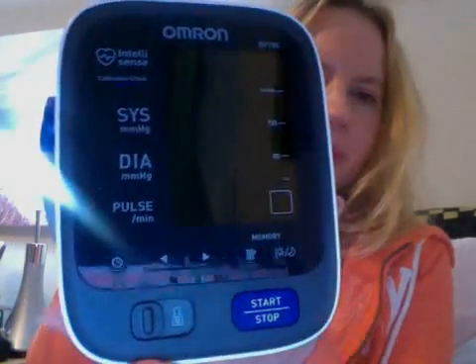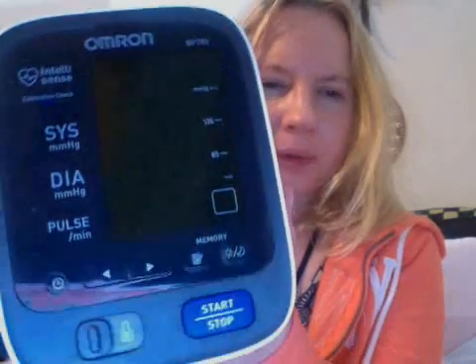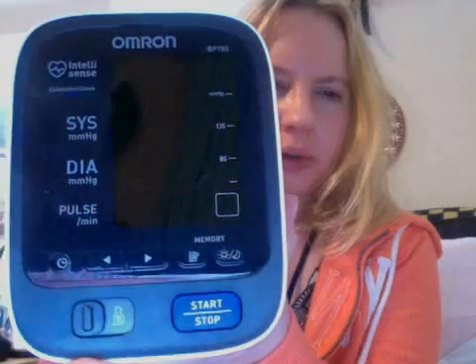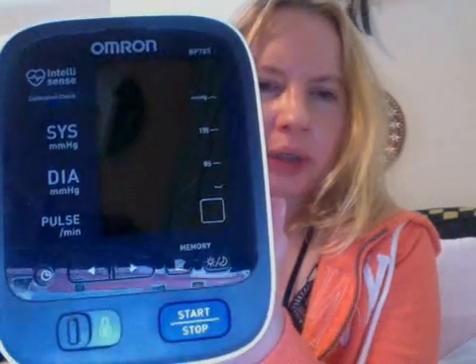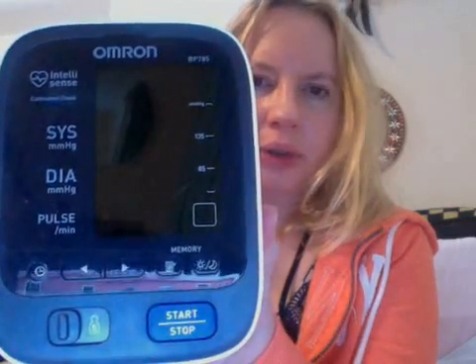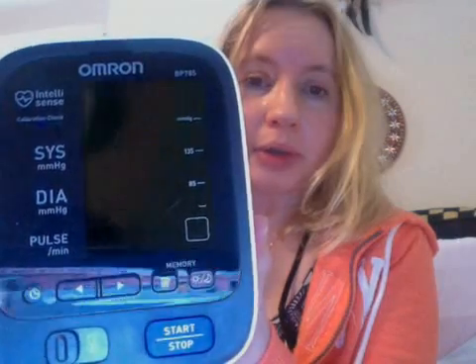First, you need to get a good blood pressure machine. I just bought this recently. It's a super duper machine which does all sorts of things. It tells you systolic, diastolic, pulse, irregular heartbeat. It stores memory for two different people, gives you averages, and tells you if the cuff is properly placed on your arm.